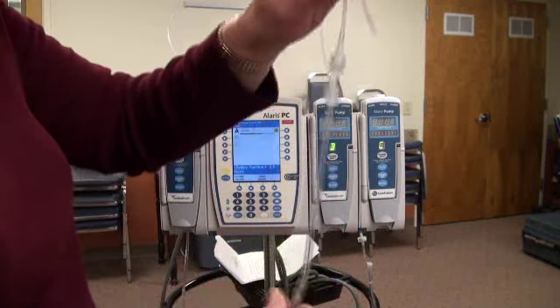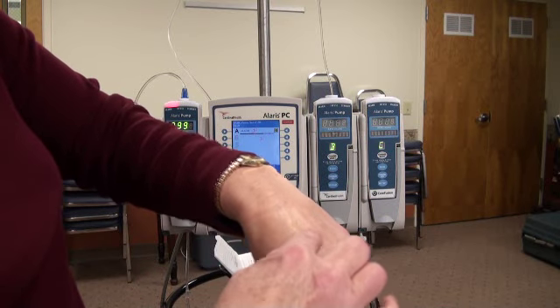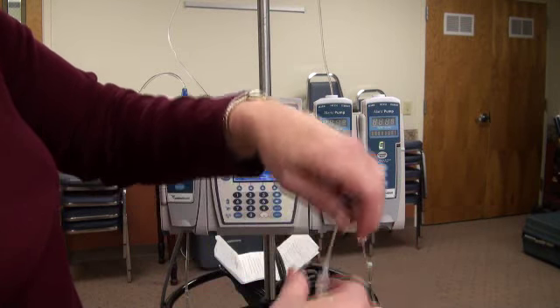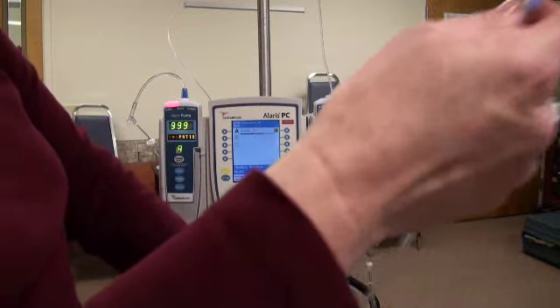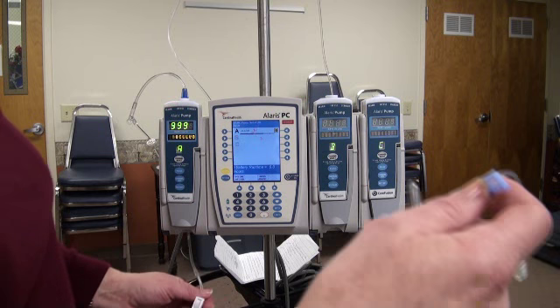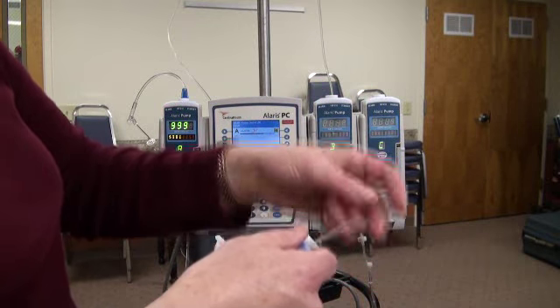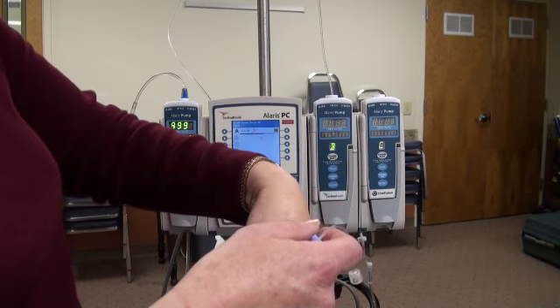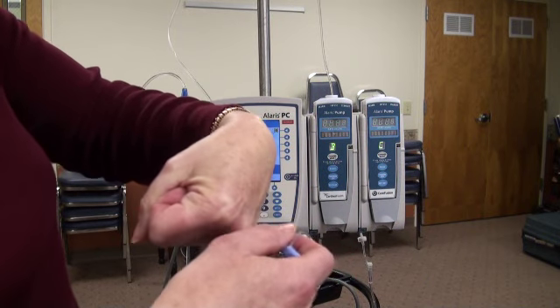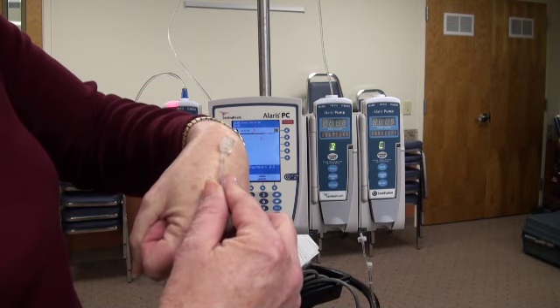We don't see any kinks. The IV site, we're going to say, is right in the hand. This is soft. We're looking up the line. We're not seeing anything. Everything looks like it should be good. It was running fine, then all of a sudden it stopped. Then we notice the patient has their hand bent at a weird angle, enough that maybe it's pulling the IV catheter out.